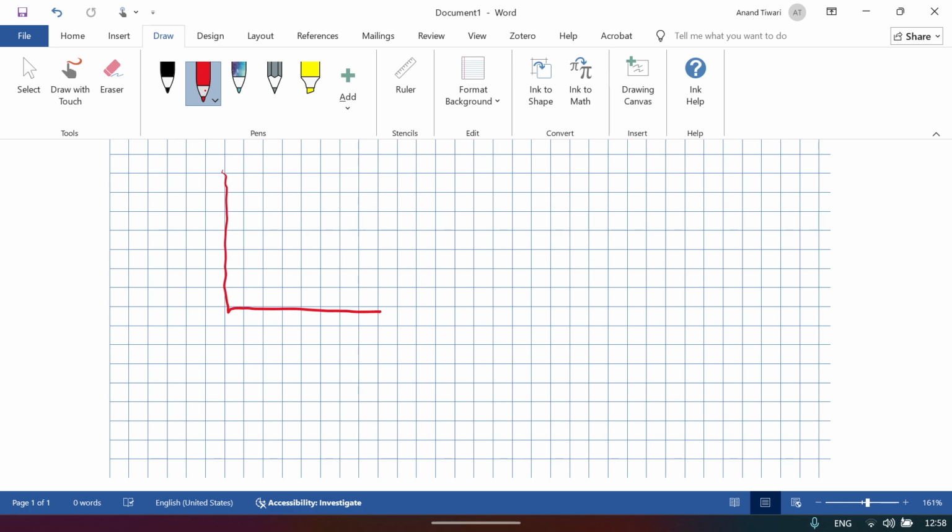If you draw the pressure time curve here, again pressure and time, I told you that the initial part is resistance because of the airway, and then there is a tidal recruitment of the alveoli, then there is expiration. You have to see the slope of this tidal recruitment, and usually you can see this along with the flow time graphic. We know that the flow time graphic is a square wave pattern.